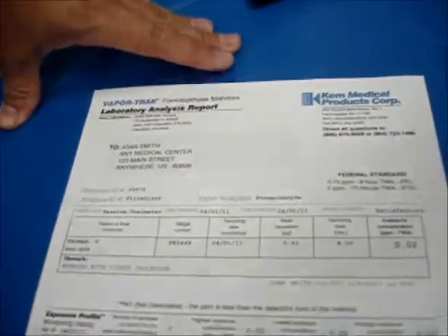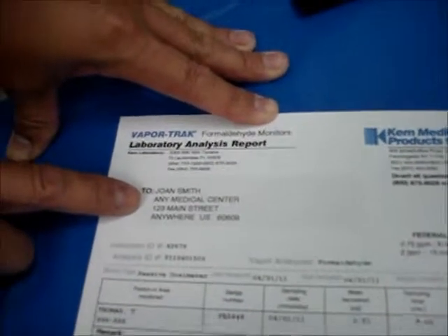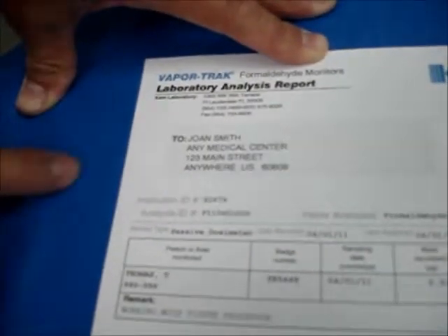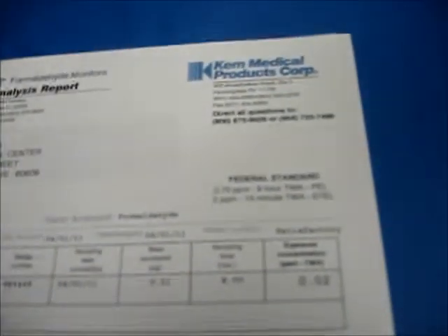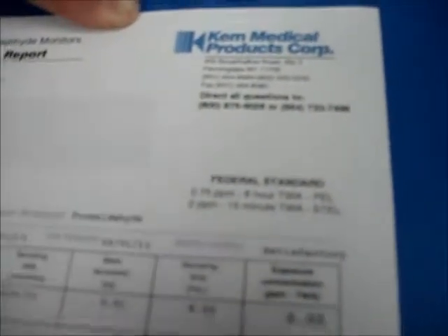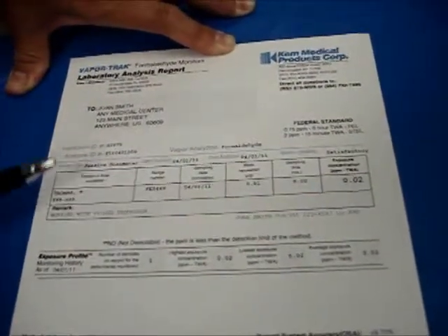After the badge reaches us, we'll send you an analysis report — a one-page analysis report for each badge used. The information is going to have the institution, the account number for that institution, and the federal standards on what the maximum allowed levels are. This particular analysis report is for formaldehyde. It lists the eight-hour TWA, which is 0.75 ppm, and the 15-minute STEL, which is 2 ppm. This area will list the monitoring badge that was used that day.